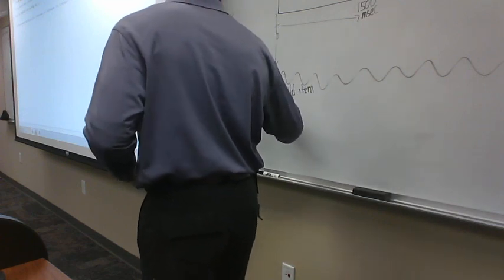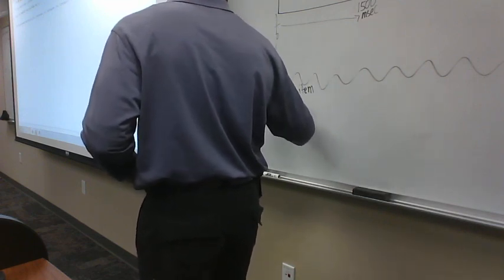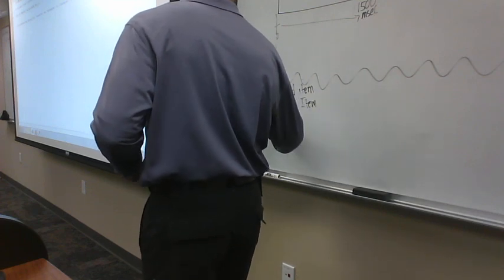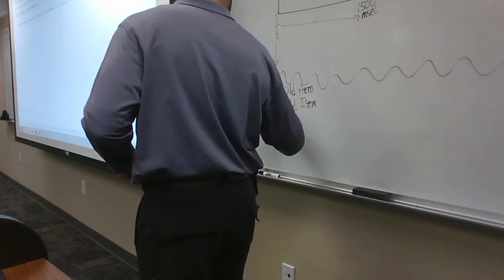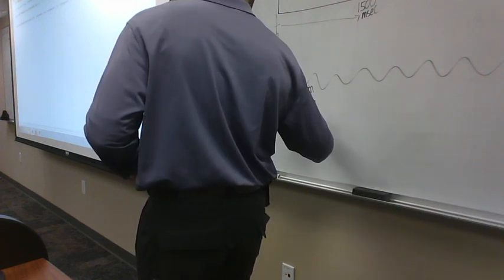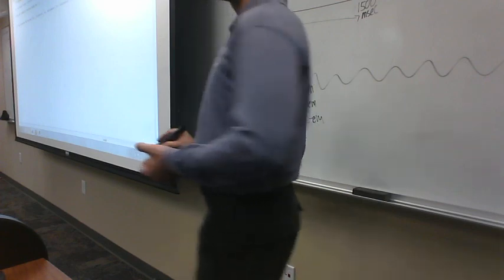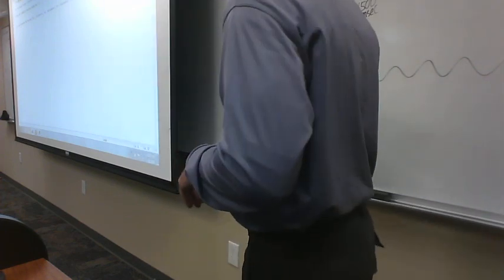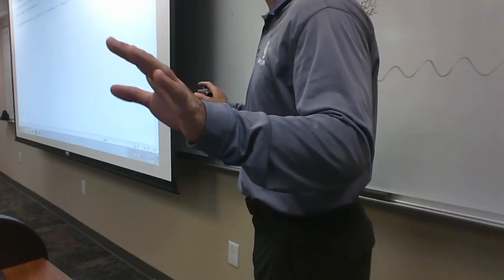Okay, 62, it's also an event code. That means it's an old item. And then 63 tells us it's actually a new item. Make sense? Okay. And we'll talk next week about why these are different. But pay no attention to that right now.